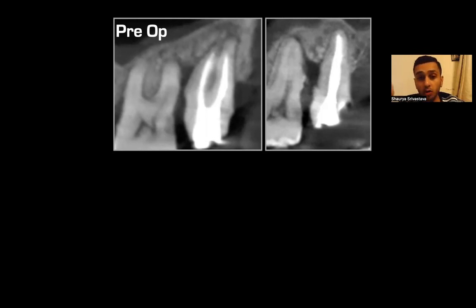Rubber dam is non-negotiable. If I could not put that on, I would have taken this tooth out. That is something that I will always say, that if I can't put a dam on a tooth, either find a way or extract it. So that was a non-negotiable. So I said, okay, let's try something outside the box. I'm not very confident about it, but let's give it a go.